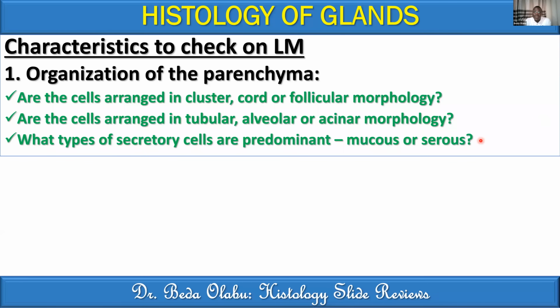There are those which contain mucus as their secretion, which means that the body fluid being released contains a high content of mucus. Because they are mucus cells, they don't usually pick up the common histological stains, the histological dyes, which are water soluble. And so they'll just appear as white. And we describe that as being a mucus acinus.